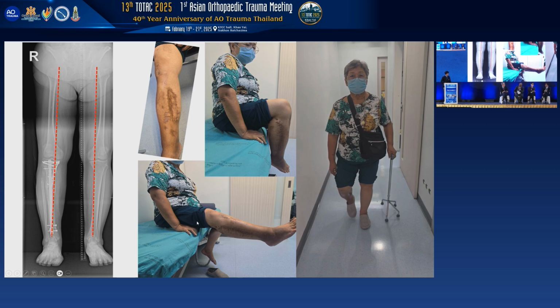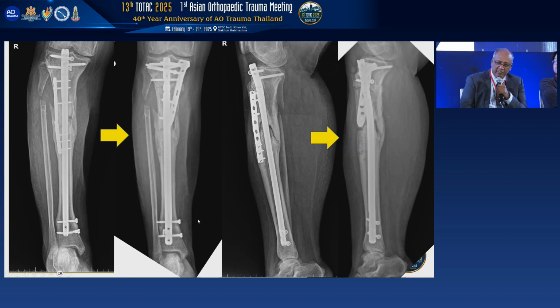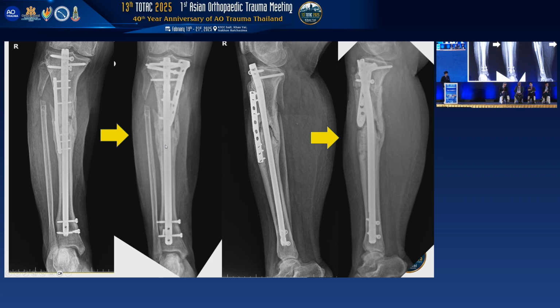So any reason for using a Tomofix and not another T-plate, the standard LCP T-plate, because the osteotomy is much lower than what you would do for the Tomofix? Also the direction of the screws, you can change the screws in the LCP T-plate, you can't change the direction of the screws in the... So for the T-plate, I want to use the bigger screw, 4.5 or 5. So what I have is the Tomofix, the long one. But for the T-plate or 4.5 from the other company, I don't have it in my hospital.